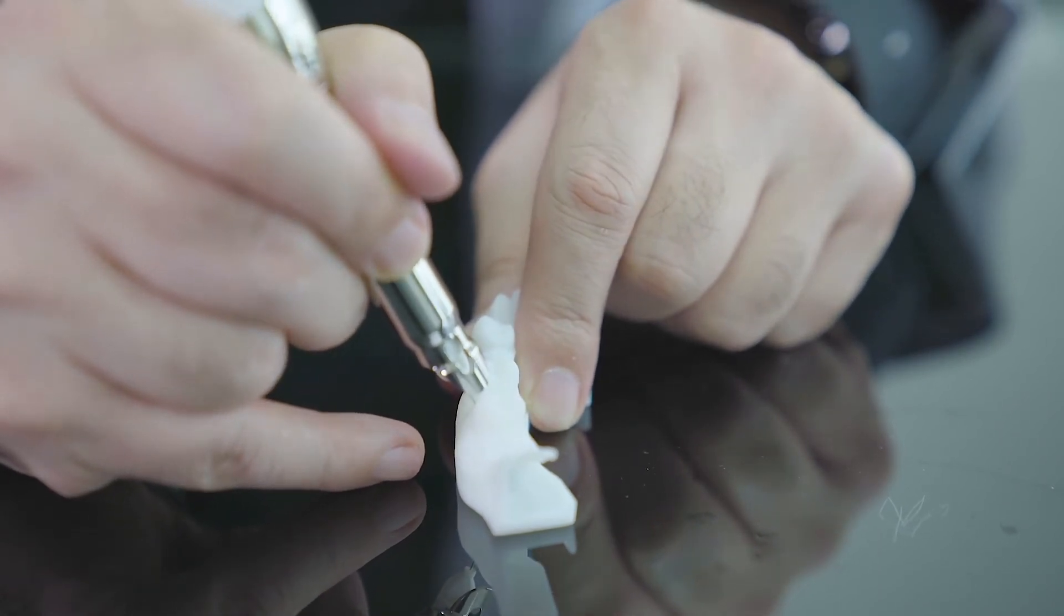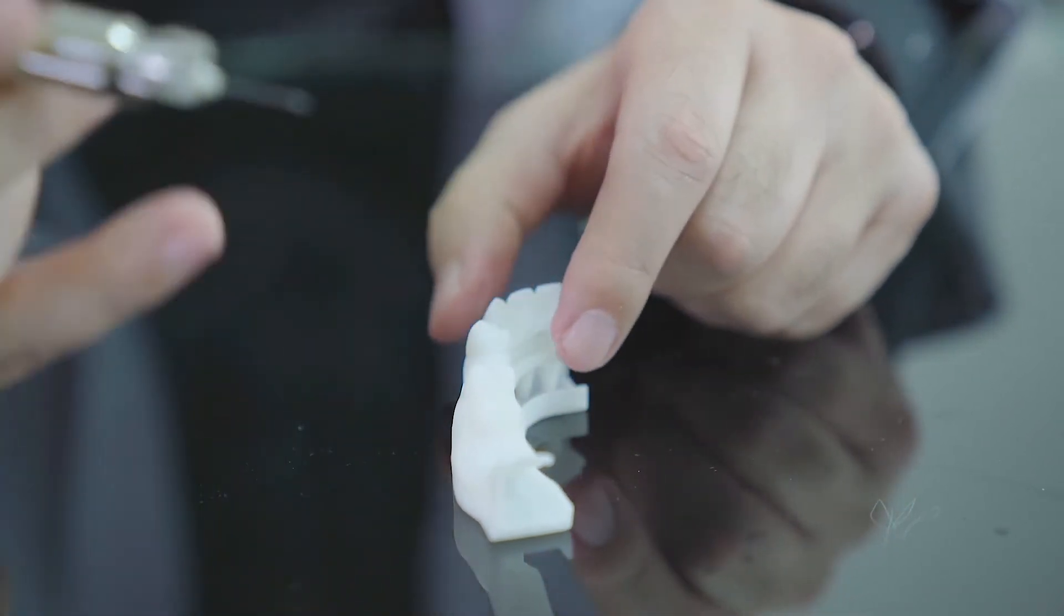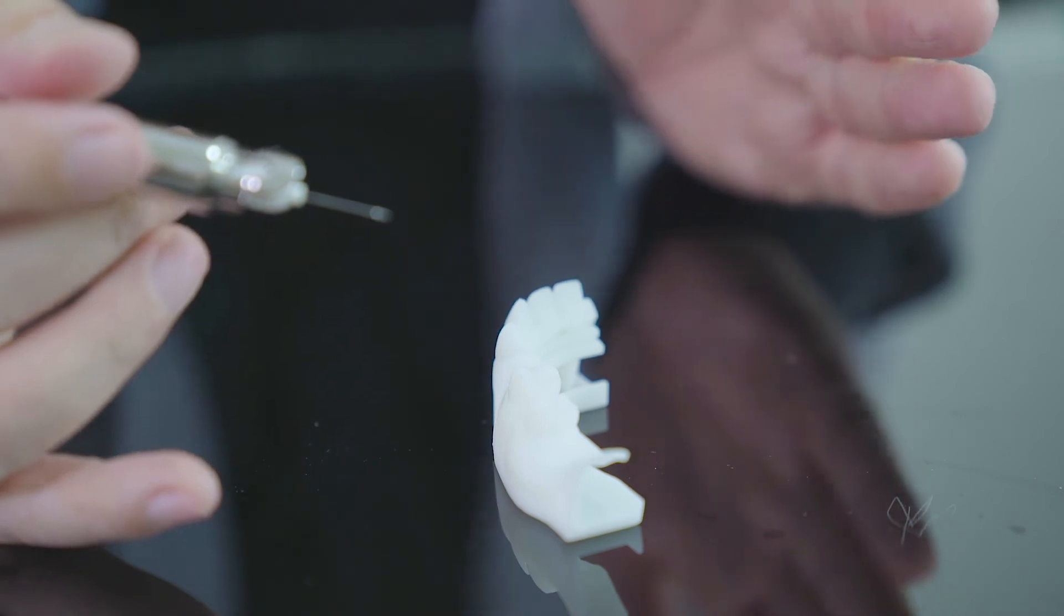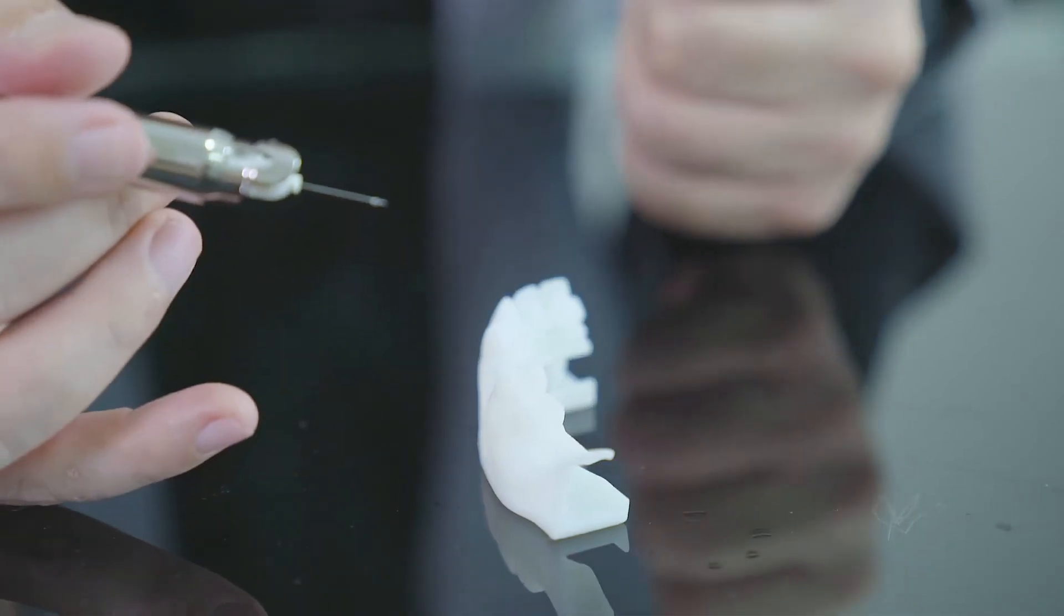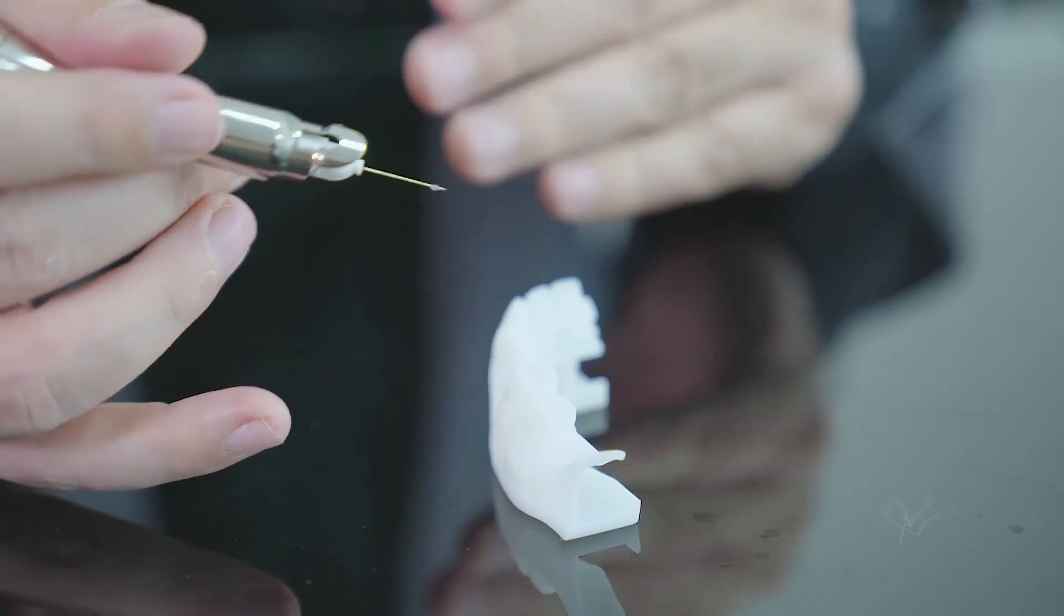That's all. Once I finish, simply I remove my needle, then I start directly my procedure. No waiting time, no postponed appointment, directly go to your procedure.